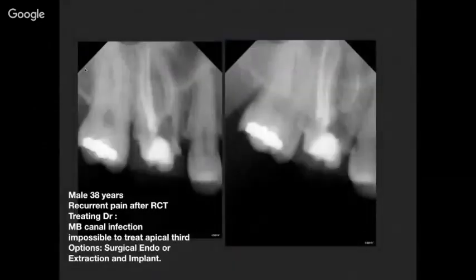So this is a clinical case where the patient was referred to us for a second opinion. Through the X-ray, you can see that there was a destructive access cavity looking for that MB2, and even the MB1 could not be adequately treated. The doctor told the patient that, because of an infection he could not control, he would prefer to do a resection or retrograde surgery, or even extract the tooth and place an implant. Well, with the CBCT, we were able to change that treatment plan and be very conservative with a non-surgical root canal therapy.